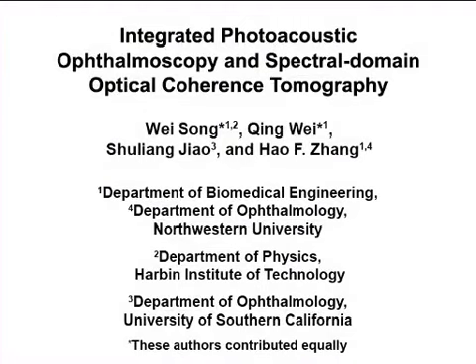The overall goal of this procedure is to demonstrate the integration of photoacoustic ophthalmoscopy with spectral-domain optical coherence tomography for simultaneous in vivo imaging of the retina in small animals.